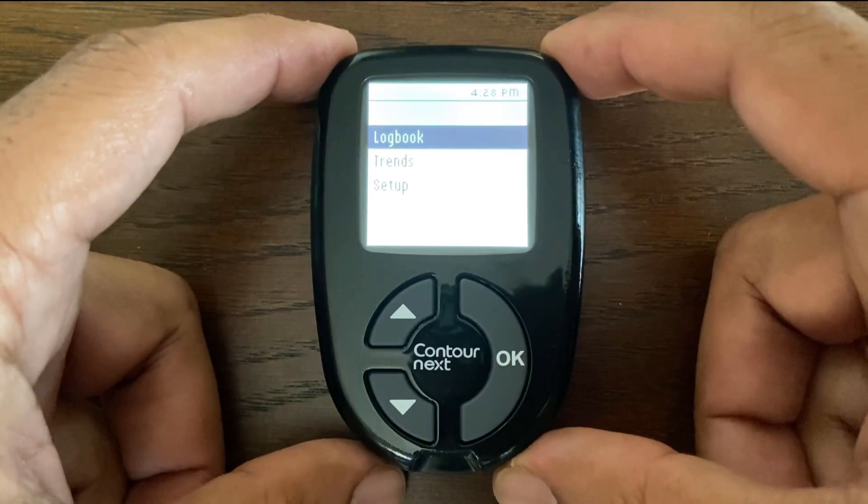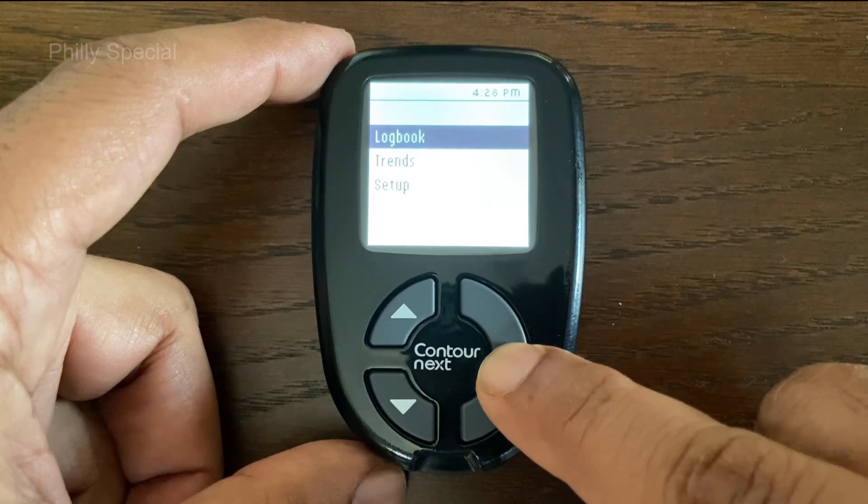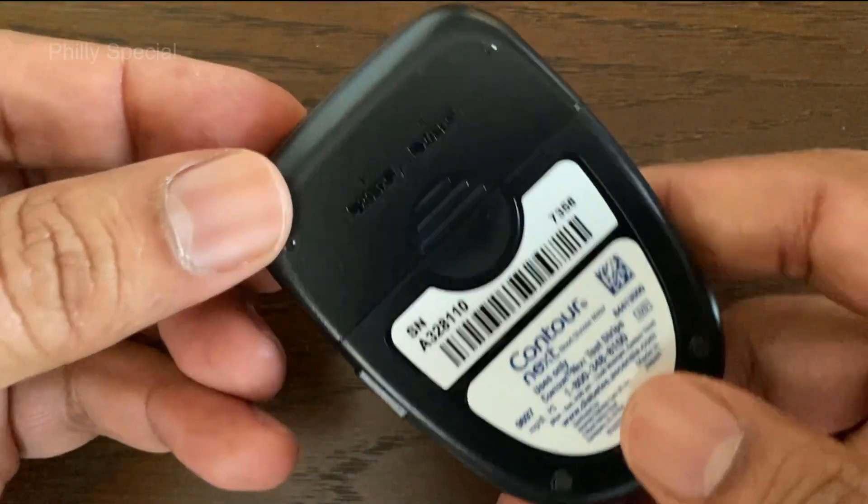In this video we will be replacing the battery from the Contour Next Blood Glucose Monitoring Meter. Before replacing the batteries, turn off the meter, then turn the meter over.